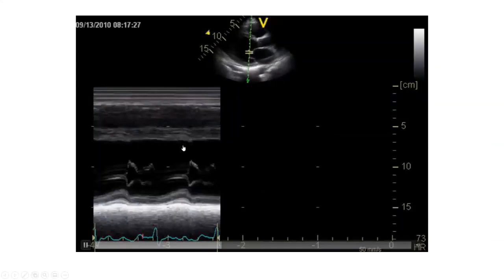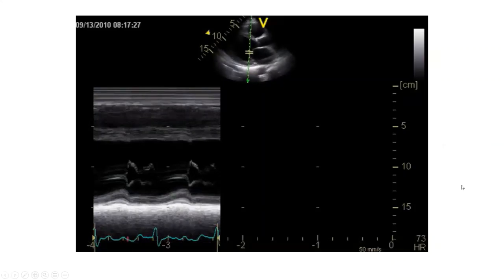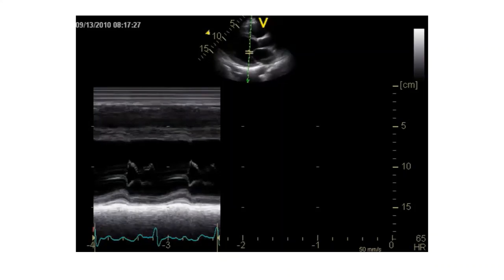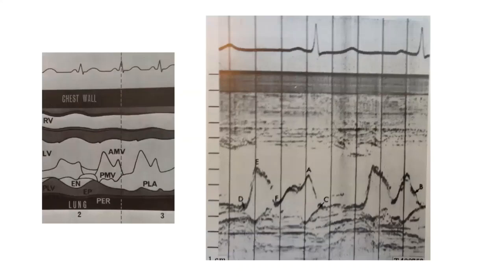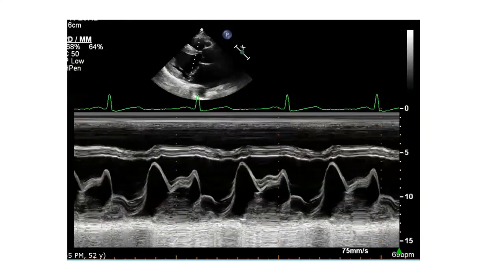Here is a patient with a widened E-point septal separation. As seen on the two-dimensional echo, overall left ventricular function is quite poor and stroke volume is low. If you are not putting much of a stroke volume past your aortic valve in systole, you will not have much mitral valve excursion in diastole. Anything greater than 6 millimeters on M-mode is indicative of an elevated E-point septal separation.